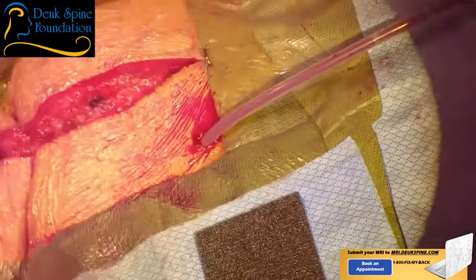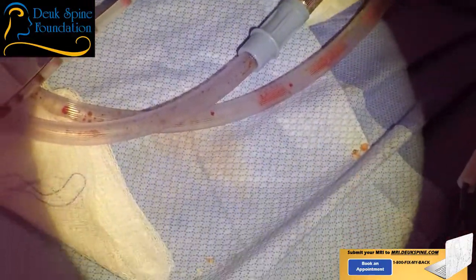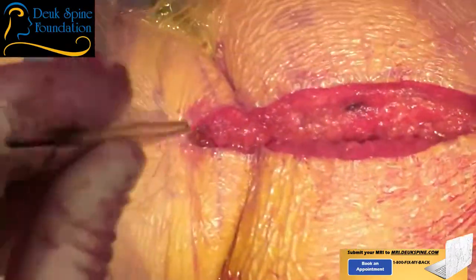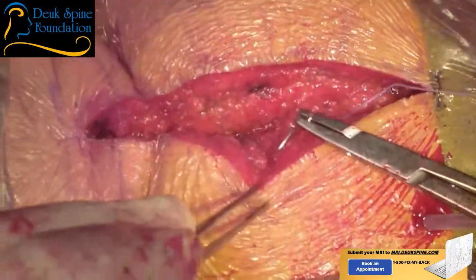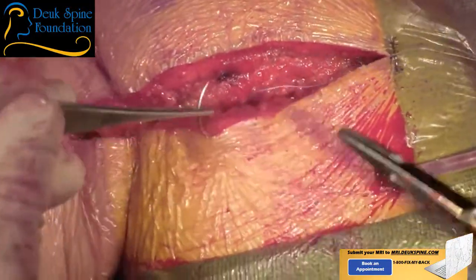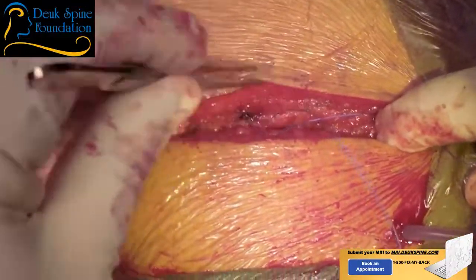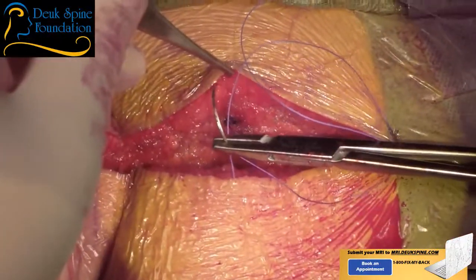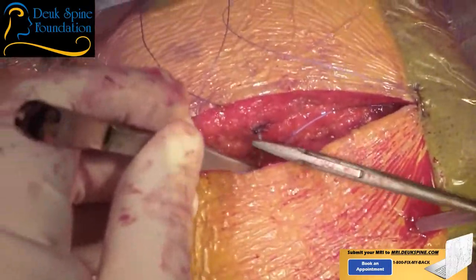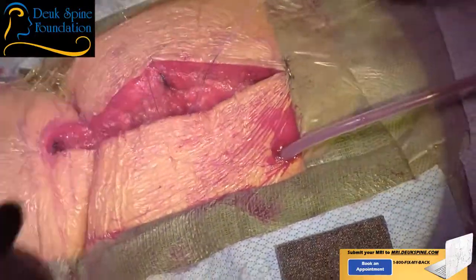I'm going to keep working then. Give me a stitch. Pick up. How many stitches do you have left? Oh, we have plenty. Good. Well, we got to move. This ain't no joke. He doesn't have IV access. Well, let me just verify here. Oh, you're good. You want a tie? Yeah, that would be helpful.